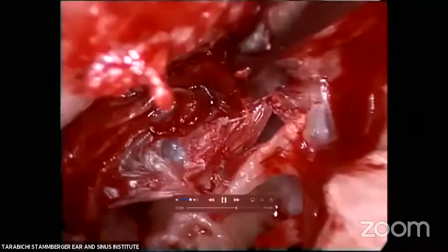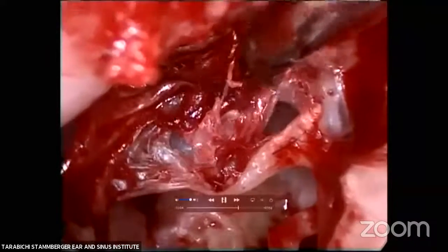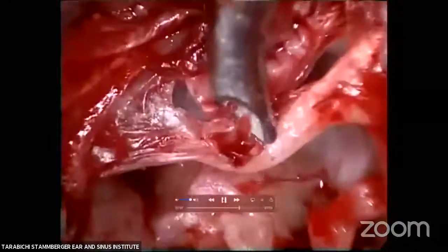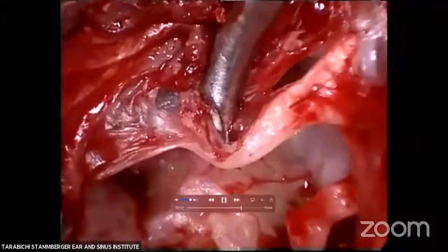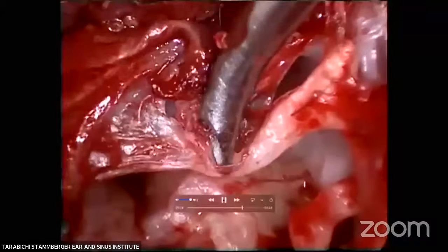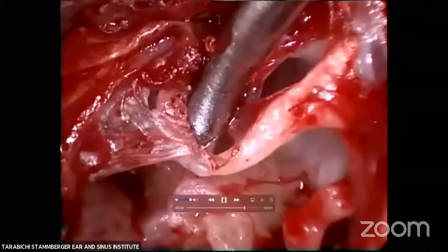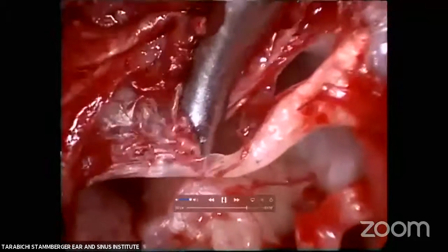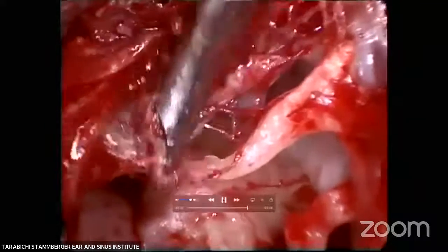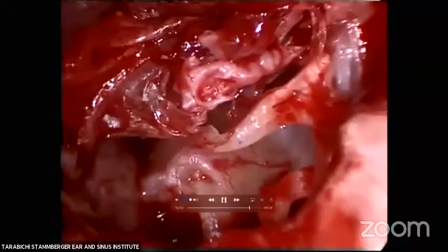So I need to go and really redo all of my presentation to show the different way that the suction instrument and the angled endoscope have changed my practice. So if you do that again, you have tremendous access into the anterior tympanic cavity.